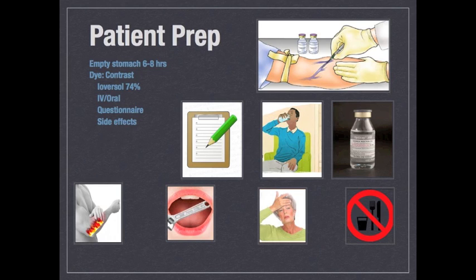the procedure and answers a few questions informing the technician of any previous allergic reactions and basic information to later identify the patient. Third, we inform the patient what the CT scan procedure consists of, which is administering a dye, also known as a contrast, intravenous to dye the arteries, and orally where he or she will be drinking a solution to dye the stomach and intestines. It is important to mention that he or she may feel a burning sensation, a metallic taste in their mouth, and or hot flashes due to the contrast.